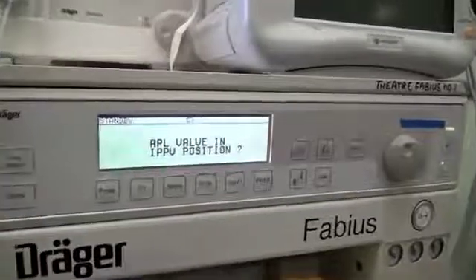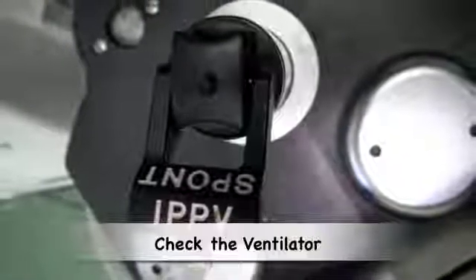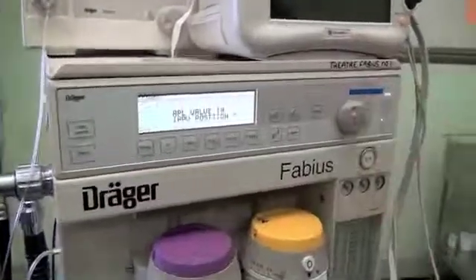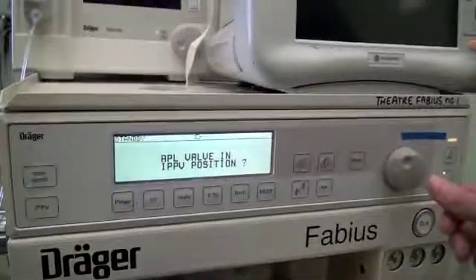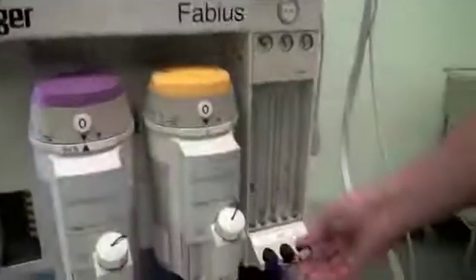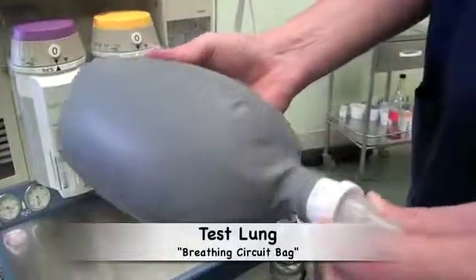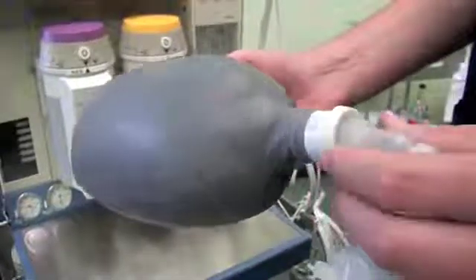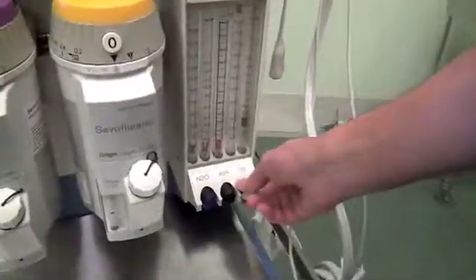The final test of the anaesthetic machine is to check that you can actually ventilate. This is done by selecting the positive pressure ventilation mode, ensuring that your APL valve is in the correct position, dialling in a fresh gas flow rate, and connecting a test lung — which is just another bag — to the patient's end of the breathing circuit. Then adjust the fresh gas flow rate to very low levels.